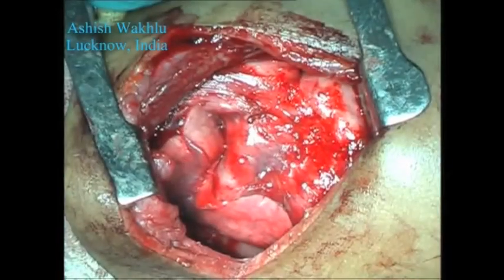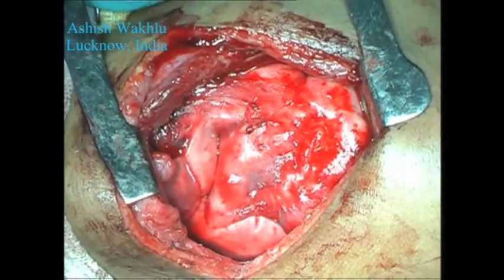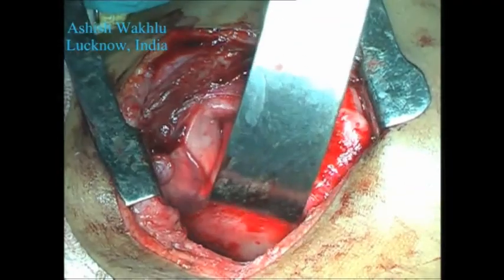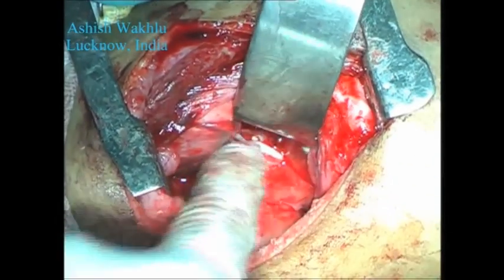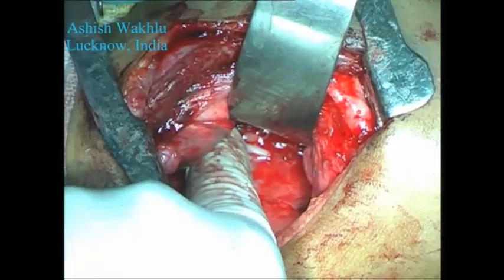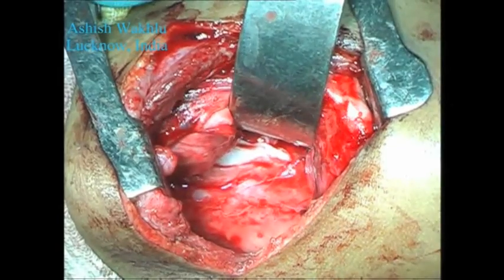We can see the right lung inflating nicely there. We had requested the anesthesiologists not to inflate with too much pressure, as that may cause an air leak from the anastomotic site. In fact, we can see a few bubbles escaping there.